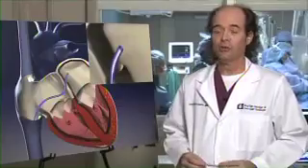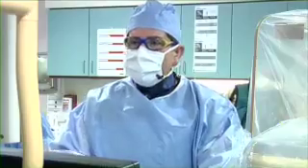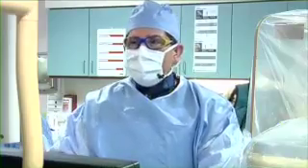Should we take another question? Or Ramon, where are you in the procedure? We are right now advancing a balloon across the defect in the septum. As you can see here in the fluoroscopy, you can see the catheter go with two markers there. That is a balloon. And we're going to inflate the balloon slowly to see the defect in the middle. You can see it there.